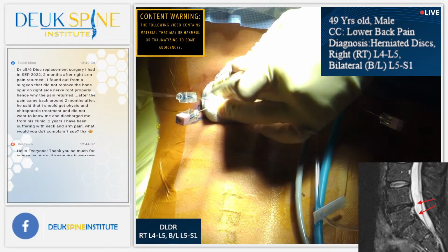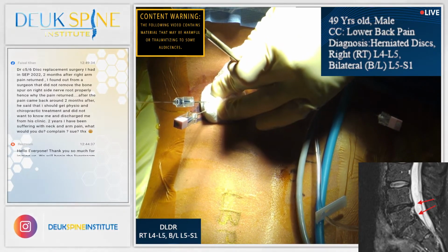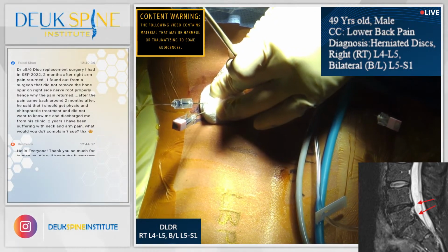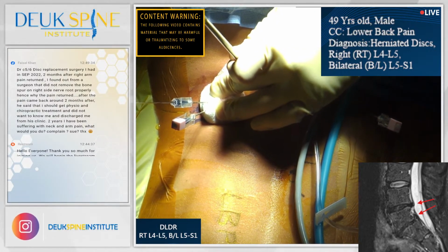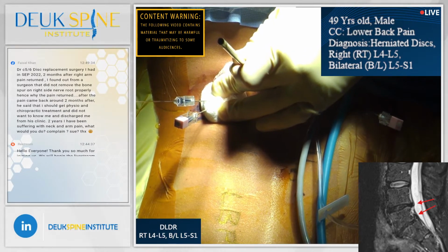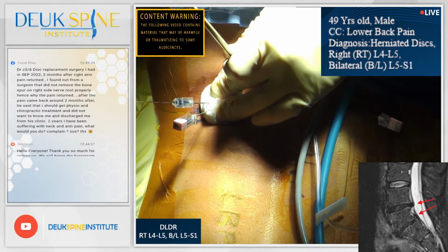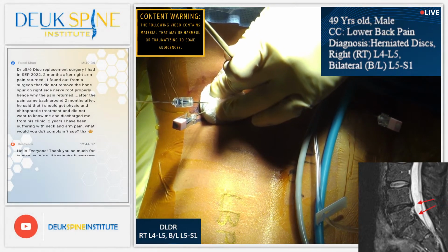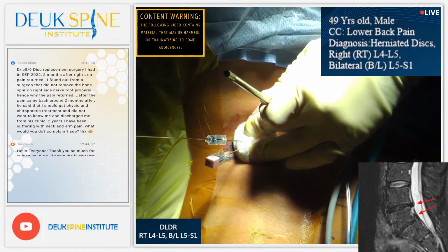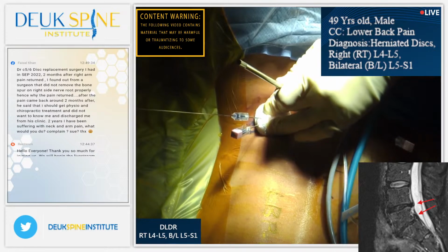So our patient has had back pain for 15 years. He's an athlete. He's got a listhesis, stenosis, spondylolisthesis, all this. He's even got a bifid spine. We didn't see a spinous process well developed or connected in the midline at L5. So he's got all this back pain coming from the discs. We're going to go in there and repair these discs. Now there's other causes of back pain besides the disc.